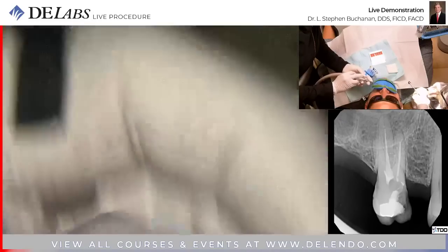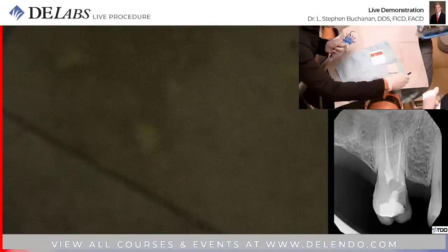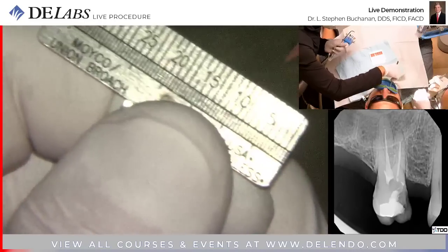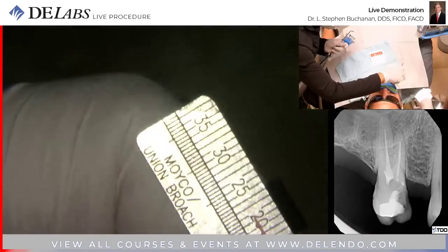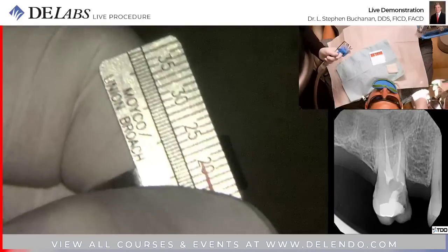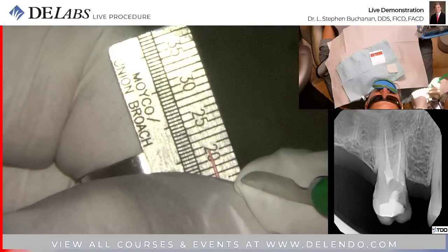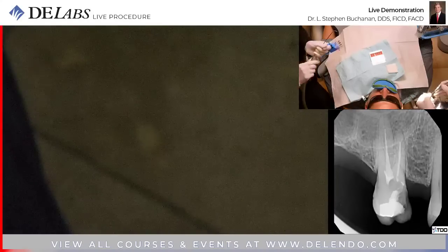Okay, pinch the cone. Place the cone at 0. Thumb on the guy, and I'm sorry, you've told me 3 times, 21. So I'm actually a half millimeter short already at 20 and a half. Let's see if that's what it looks like inside there.